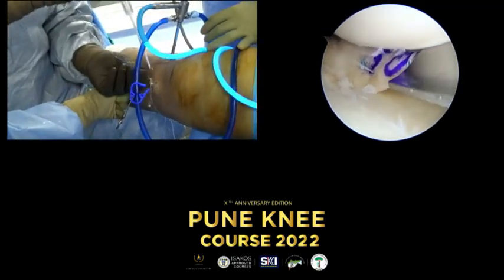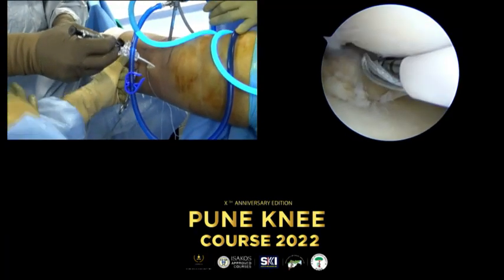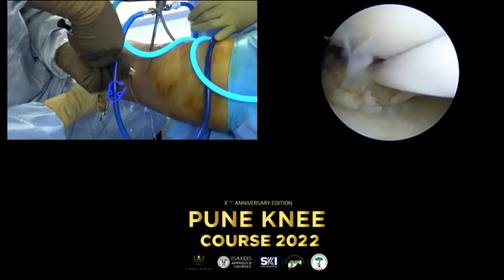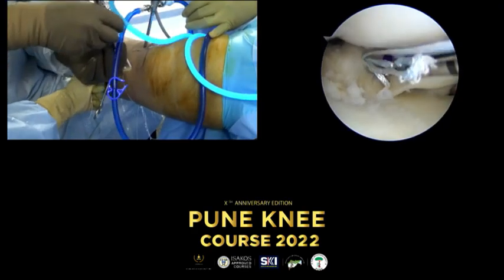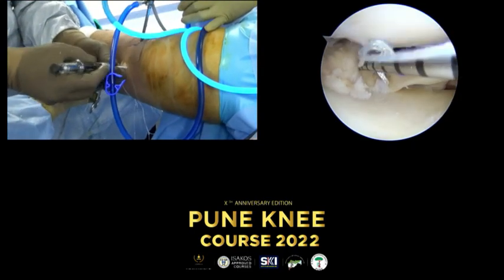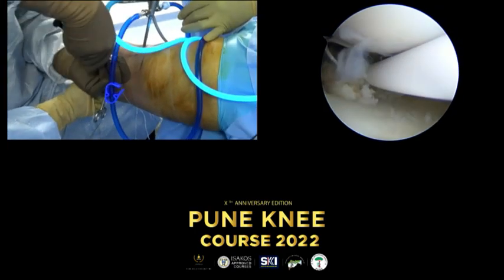A question about the posterior tunnel. Do you always drill from the medial tibial plateau, or is there a point in doing it from the lateral side? Because you'll get a pull in that direction too. Yes, fully agree. Some cases I do it from the contralateral side. In this case, we were already with the ACL. I had already the incision. From a biomechanical point of view, it probably makes sense to go from the contralateral, from the other compartment.